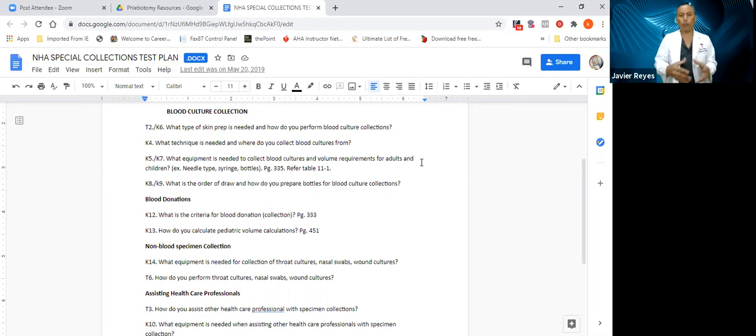So what do you do with the samples after you bring them in? Well, these samples are then put in a broth, in a medium where the bacteria, if there's any, will grow. It's placed in a warmer, and you let it sit there for about 2-3 days, and your final report will come in 3 days, and it's going to tell you if there's any bacteria.